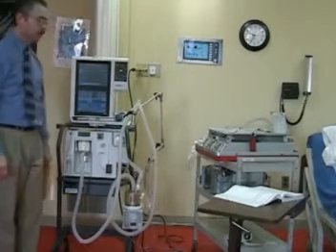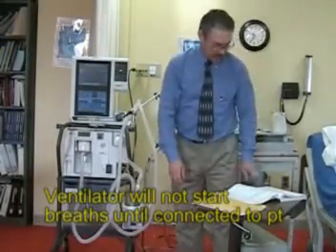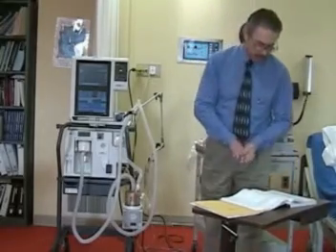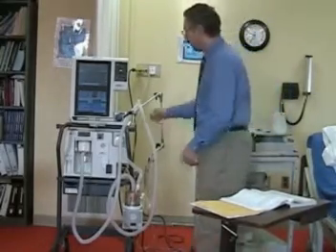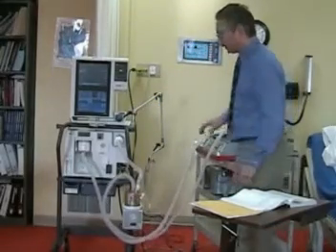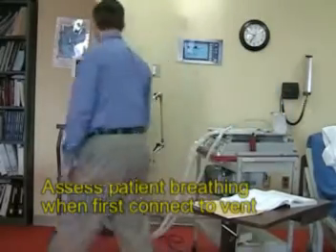Now the ventilator is waiting to be connected to the patient. We've done our measurements. We've assessed the patient's rate, volumes, all of that earlier. And now we can connect the patient to the ventilator. The ventilator will start ventilating for the patient.